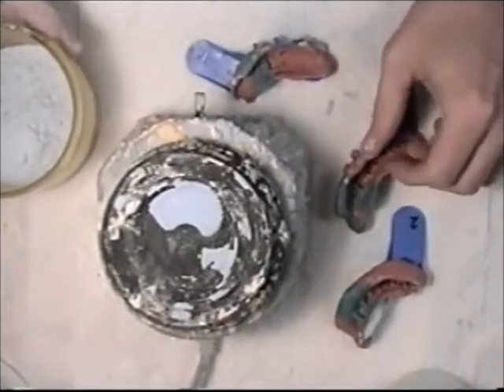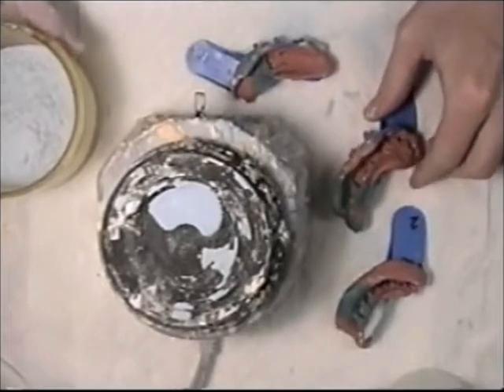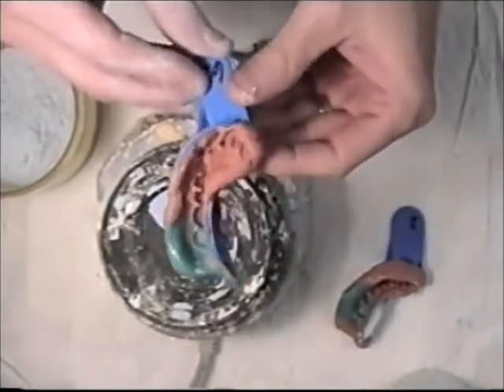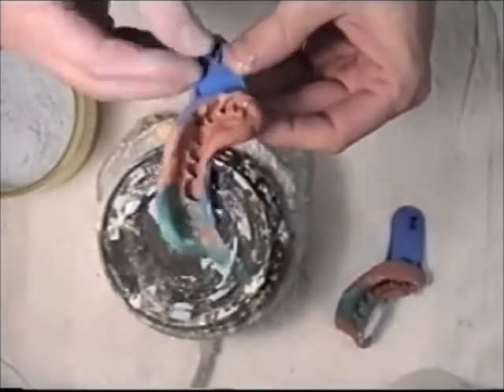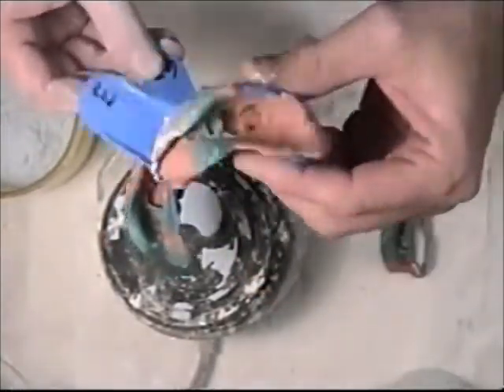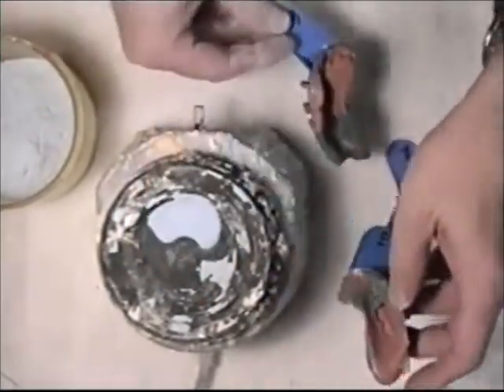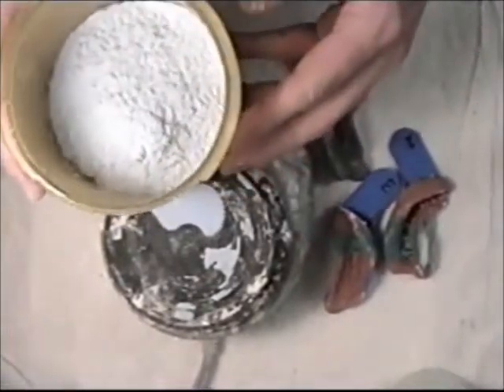I have some dental impressions here that we're going to pour stone into, and this is what they look like. I have some powdered die stone.